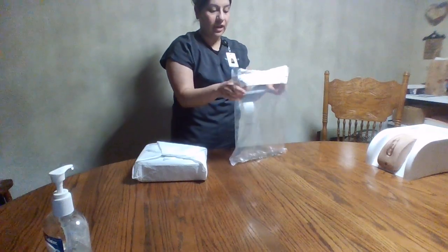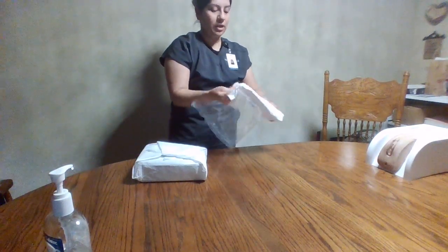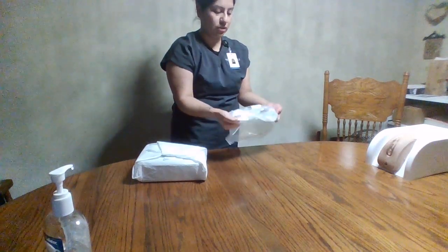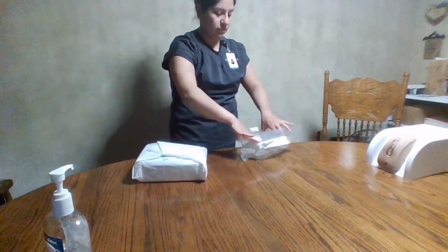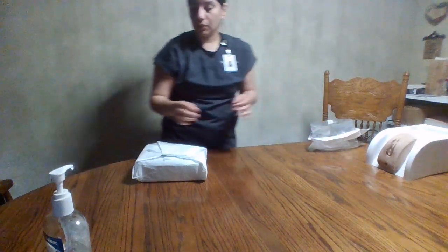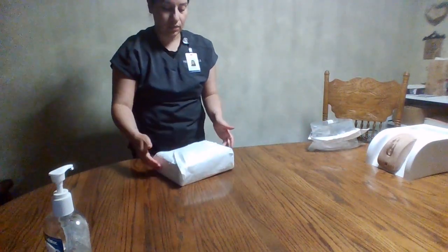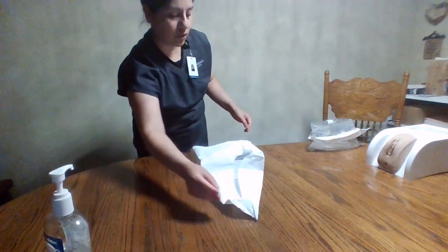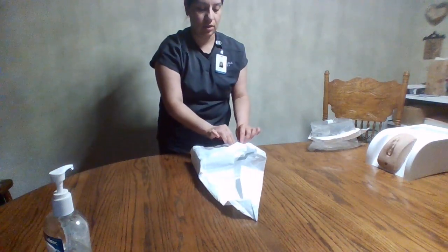With the outer of the kit, I will place that to the patient, using this as a trap. And we'll make sure to open the kit.